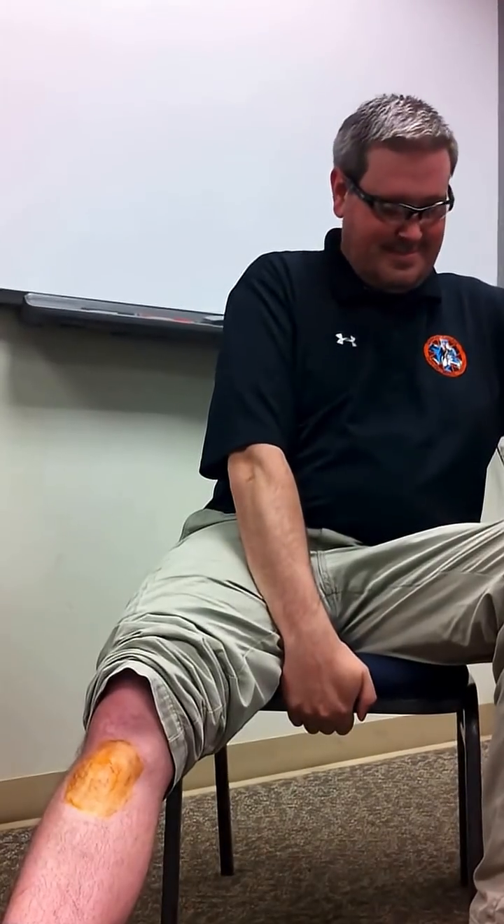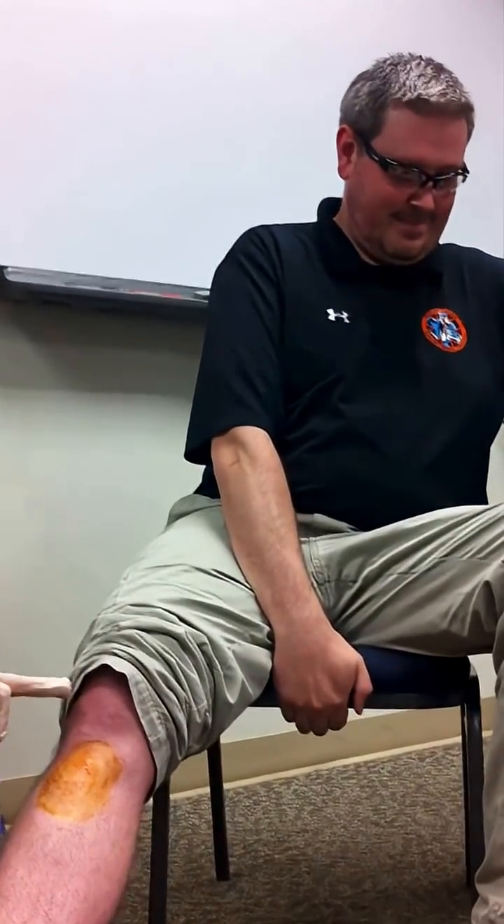I'm ready. You ready? The battery's dead. Sorry, dude. Yeah!